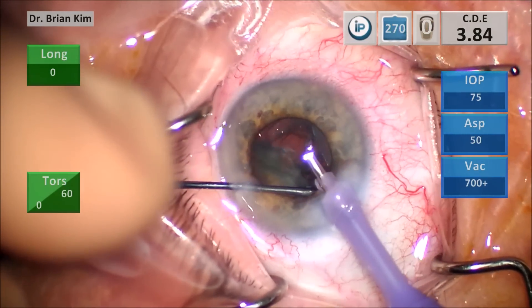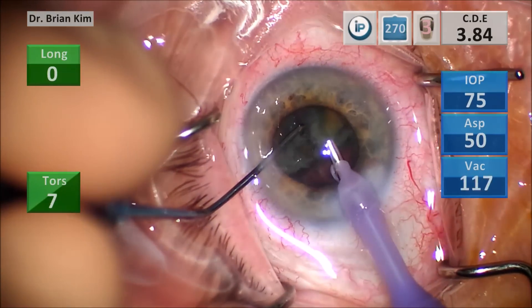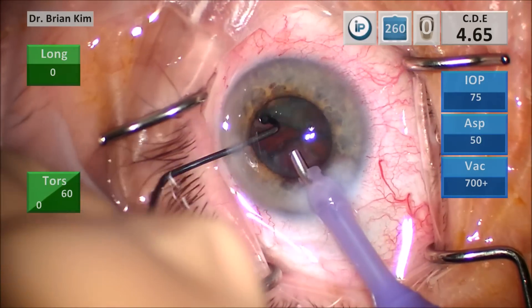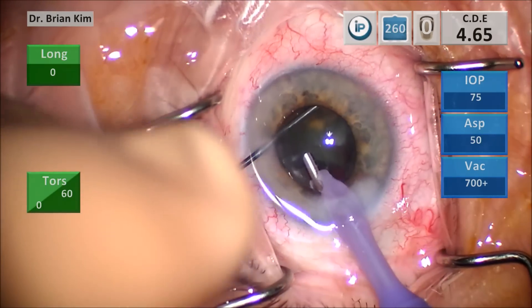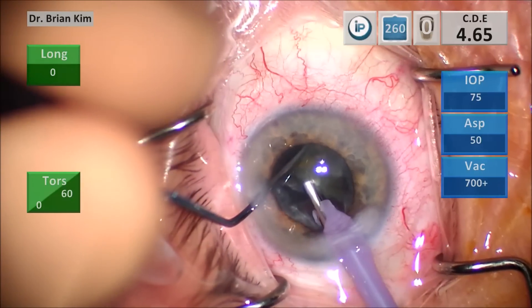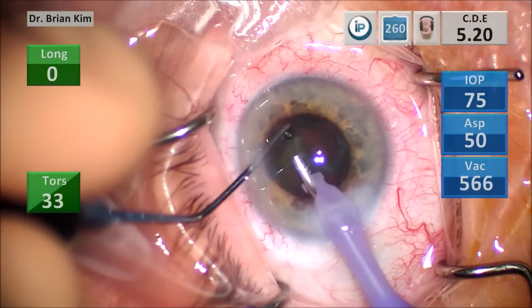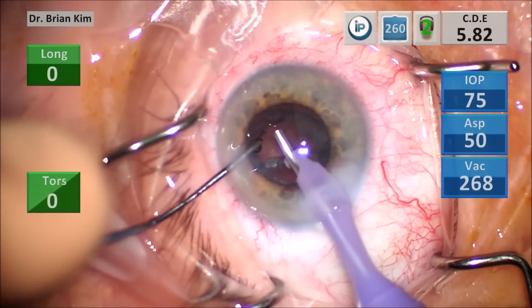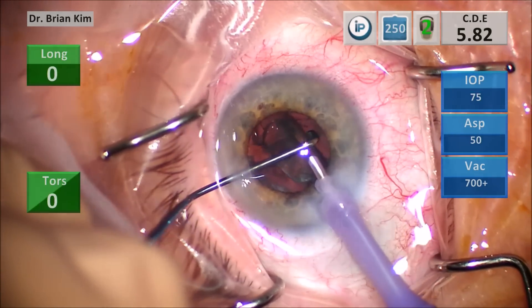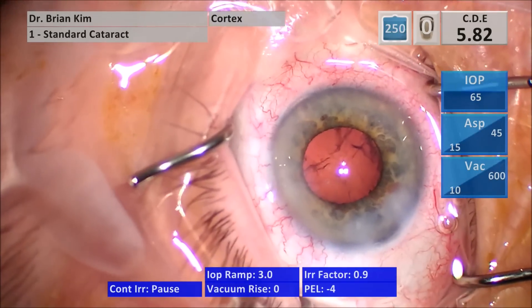Sculpting surgeons are used to using the FacoTip for most of their action because they're sculpting, and they use the second instrument simply as a manipulator or just to hold the posterior capsule back or to crack. I believe sculpting surgeons have a tendency to use the Faco tip for more intraocular manipulation, and in my opinion that is less safe. You want to use your second instrument to do all of these manipulations. I didn't quite get around the piece, so I started over and went out to the equator and grabbed that last fragment. This is also an example of using the chopper to grab epinucleus — some people go after epinucleus using the Faco tip, which is very dangerous because you can inadvertently cause a posterior capsular tear.